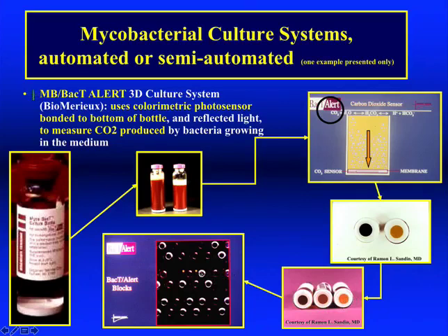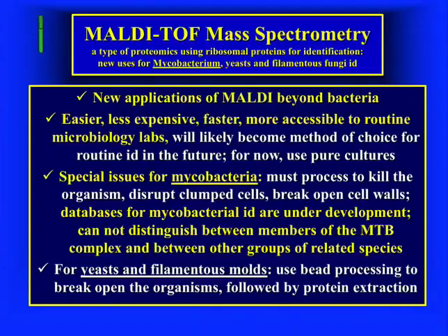Third shift can do it if they're not microbiologists, and just do a smear and report at least a smear to the laboratory. These are systems that basically go on 24 hours a day, and they detect every 10 minutes. So they have become invaluable in our quest for quick time to positivity and ease.